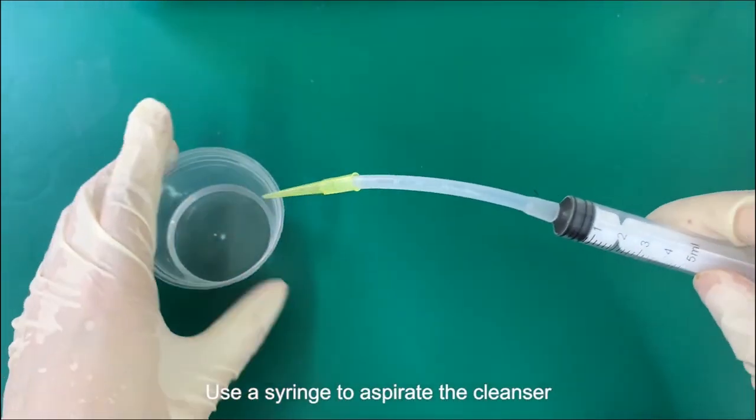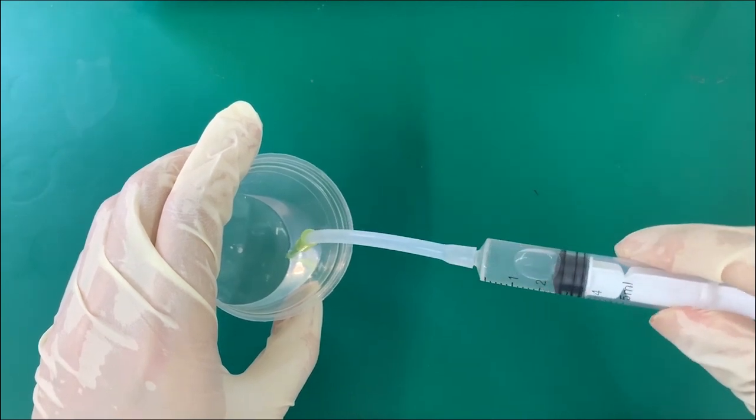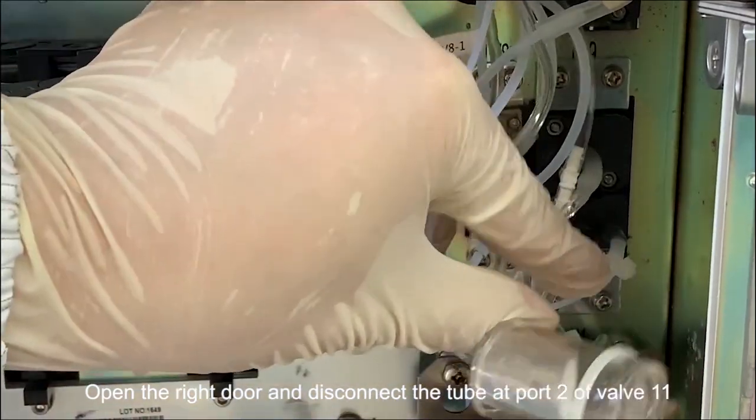Use a syringe to aspirate the cleanser. Open the right door and disconnect the tube at port 2 of valve 11.